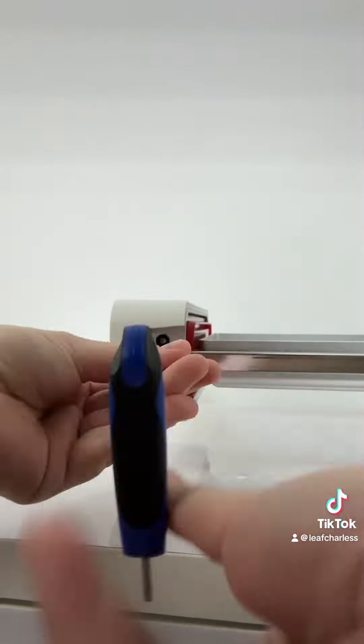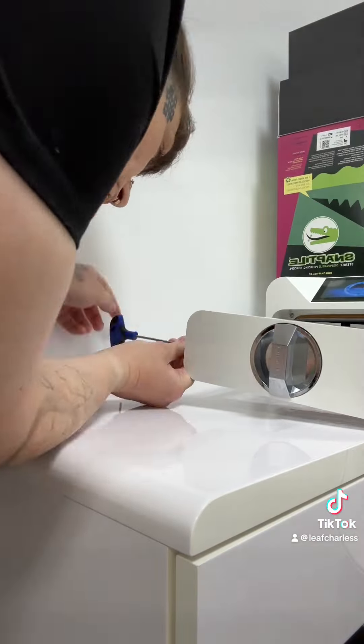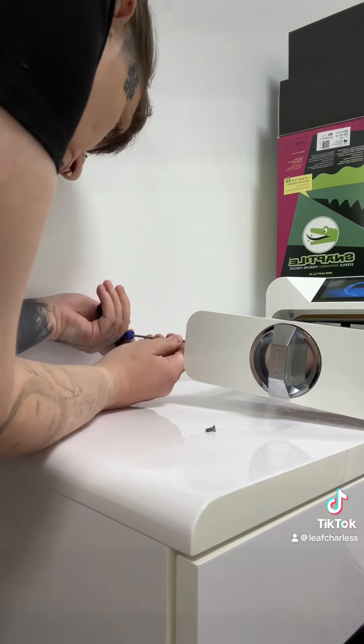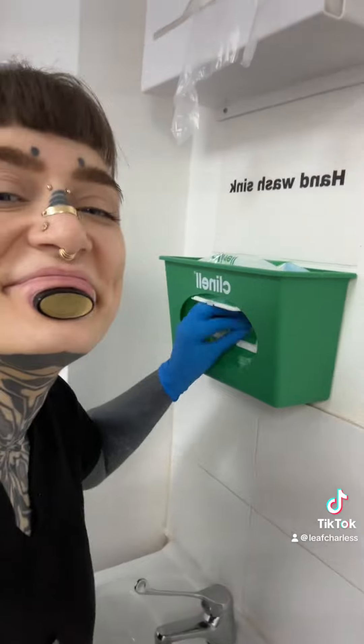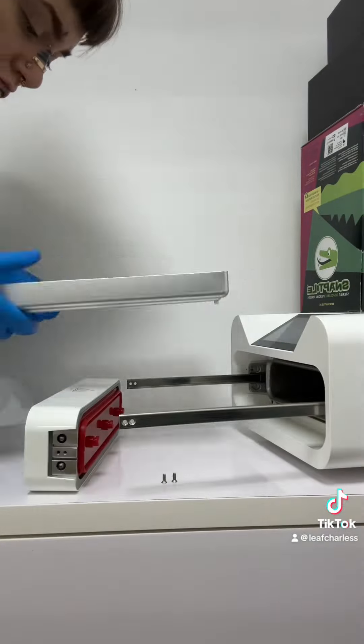See these two screws right here? They are the ones that need to come out on both sides. I'm doing a time lapse because it's a bit boring — don't lose the screws, do not lose them! Get around the other side and do that too. I know, super boring, but we have to do this every week.